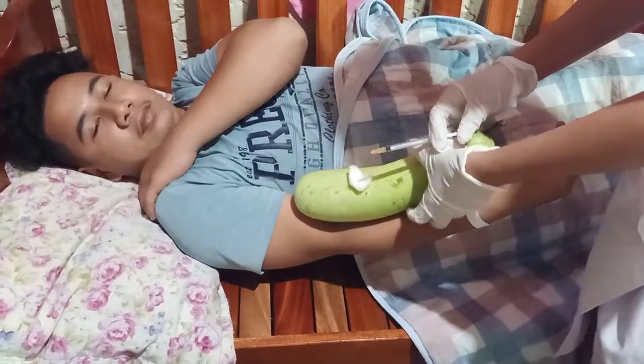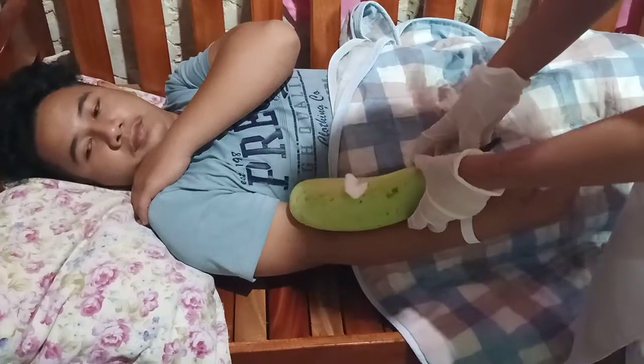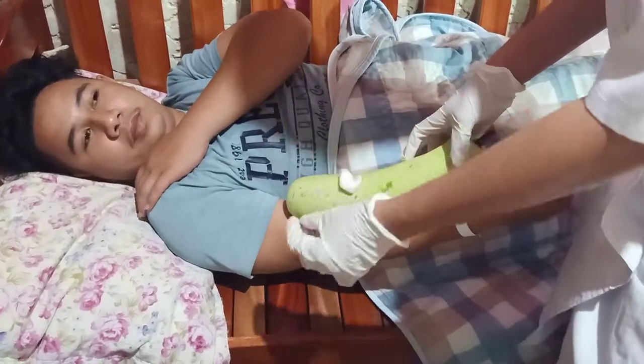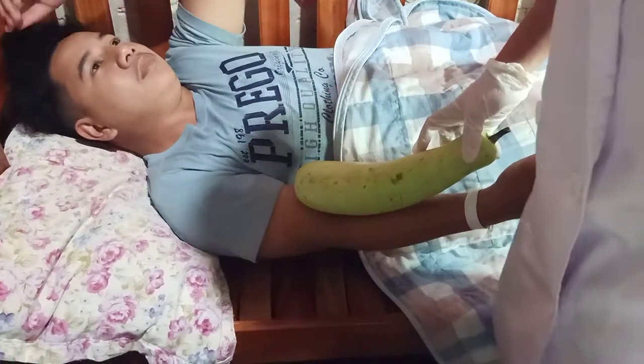Now encircle the bleb with a blue or black pen and instruct the patient not to rub or erase the mark.